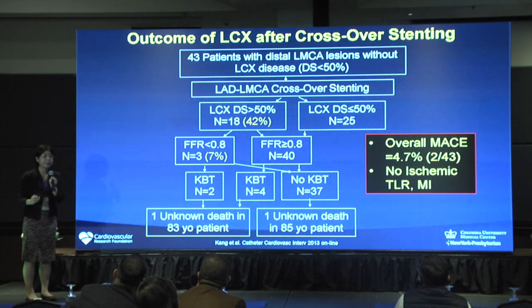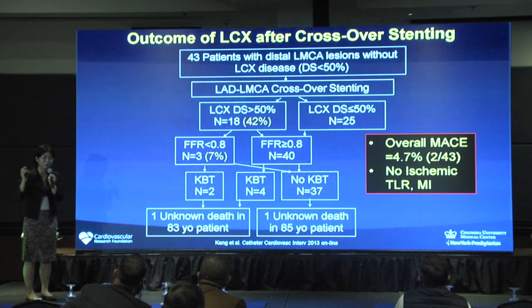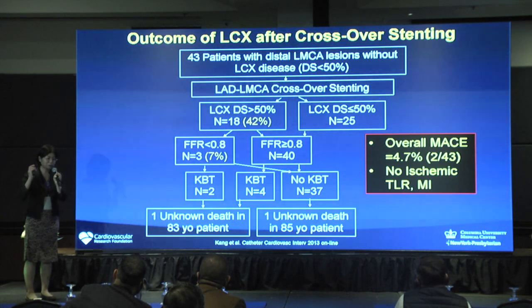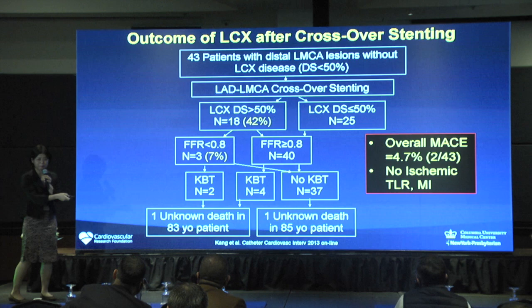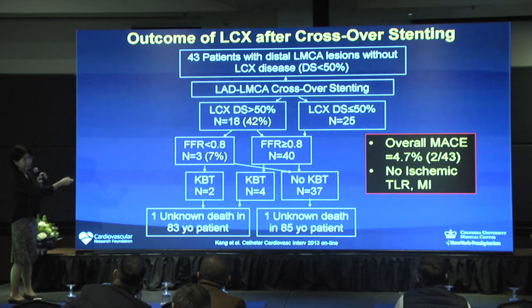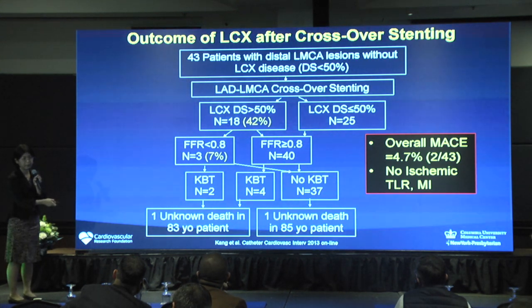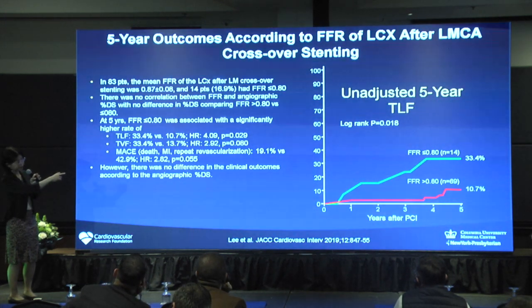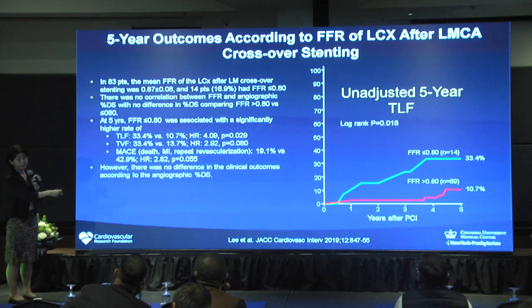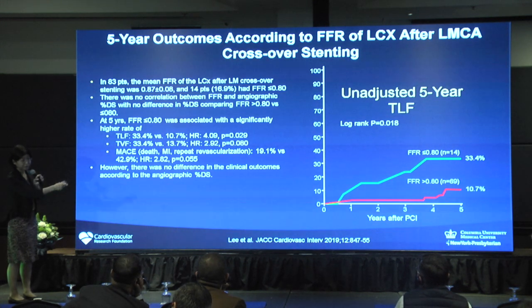What does this mean? If you confirm the circumflex ostium is good, if you do the provisional, most of the time you are okay, and they have a good outcome. So confirming at the very beginning is very important. And then the question was, is FFR enough to confirm that it's good? And this is the data. If the FFR is negative, they are getting a good outcome. This is a long-term outcome.